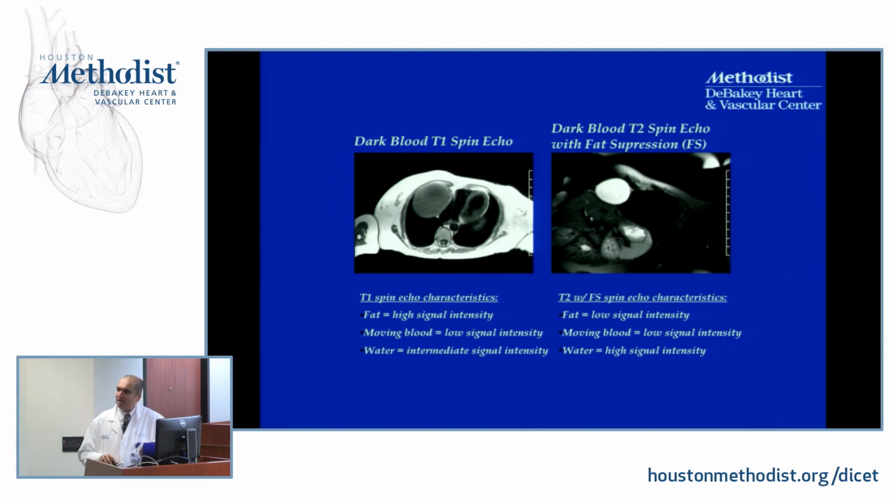So if I show you an image and say, what is this? The first thing you want to know is what kind of technique we're using, because again, the same thing can appear very dark or very bright depending upon the specific technique that we utilize.